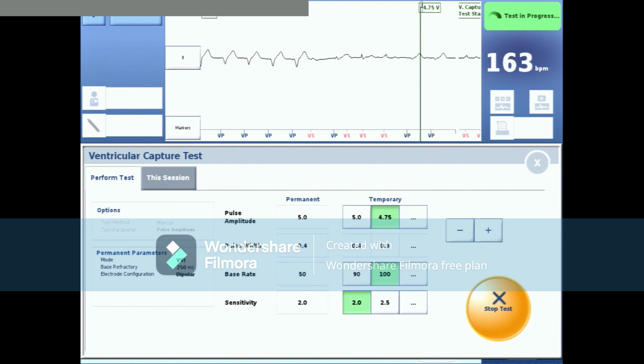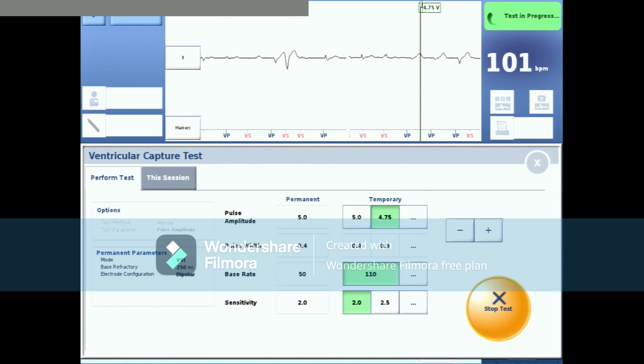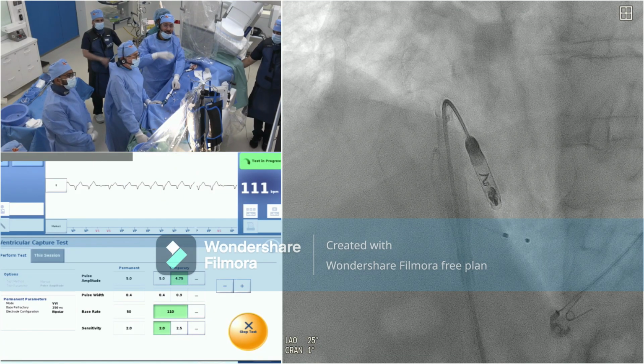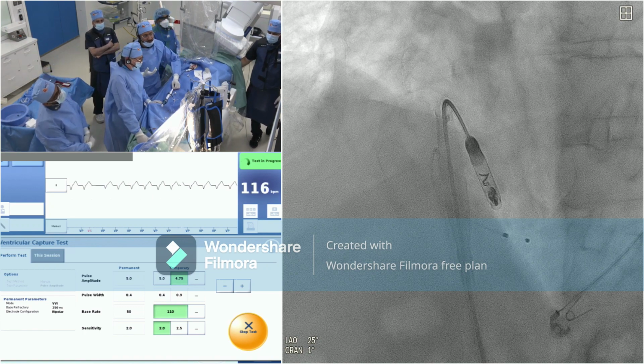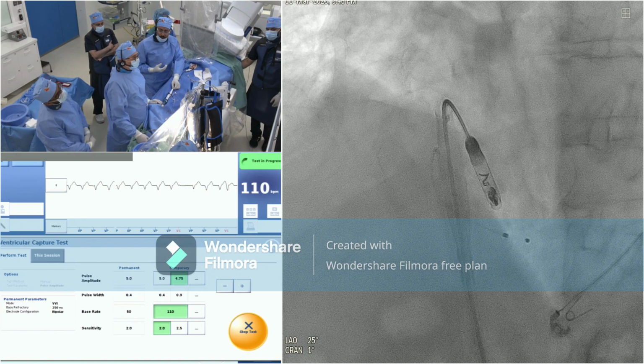So we came up with a pattern. If the values are improving after 5 minutes and after 10 minutes, this means it's going towards improvement. So hopefully next morning everything will be fine. But after 5 or 10 minutes, if it's not improving and it's getting worse, I think you should reallocate. This is from the experience that we developed from our procedures. You agree with me, Dr. Raed? The same. Very reasonable, yes.